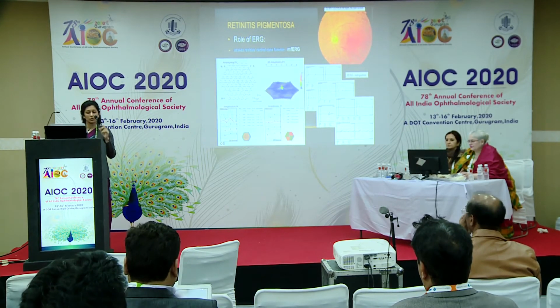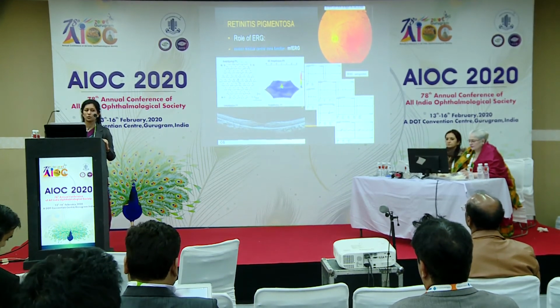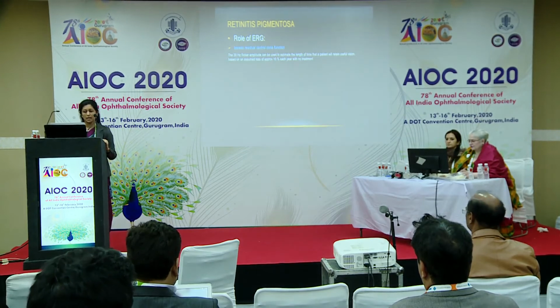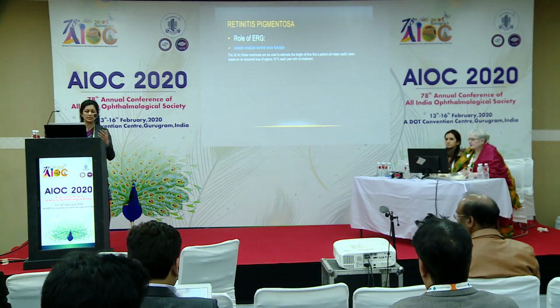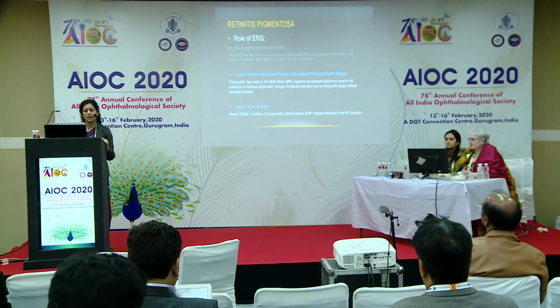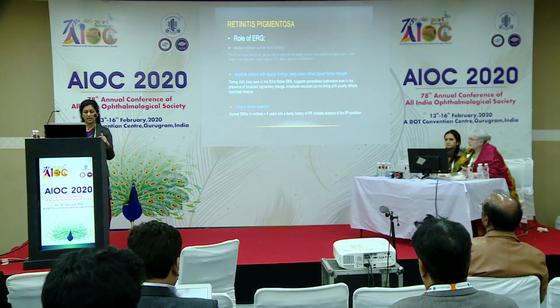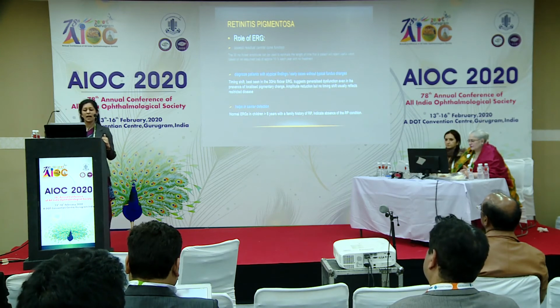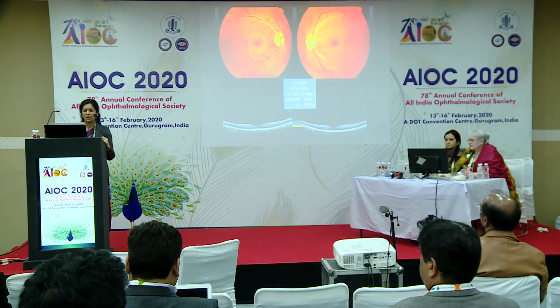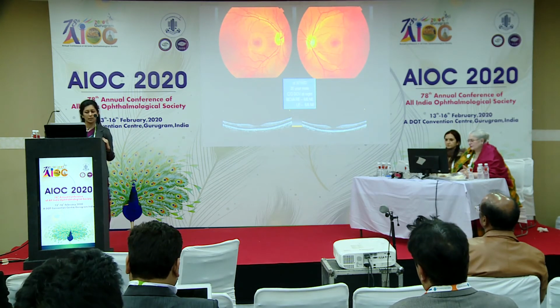We can use multifocal ERG to assess the residual cone function to follow up these patients. It corroborates well with the OCT. The 30 Hertz flicker can also be used because most often than not, these patients want to know the prognosis, and this can help us to do that. ERG is also important in diagnosing patients who present atypically or in early cases without typical fundus changes, and also in carrier detection.